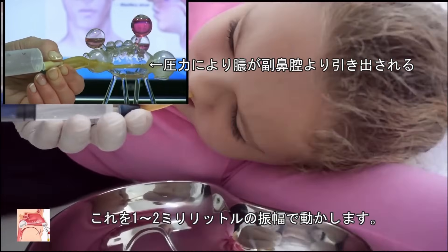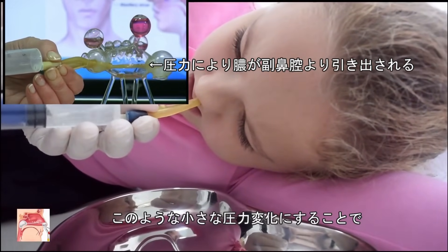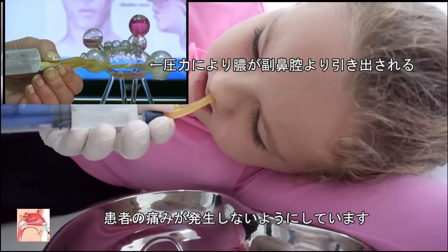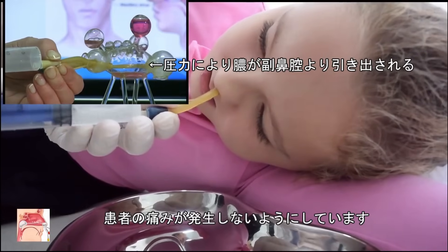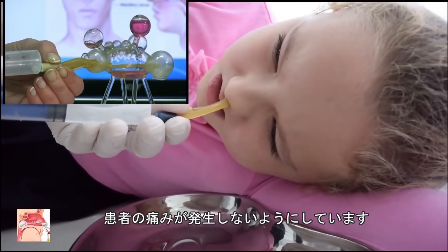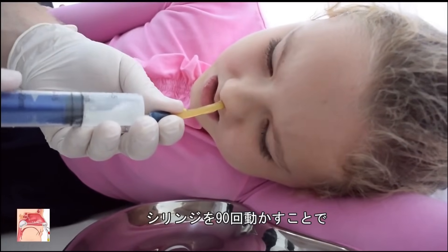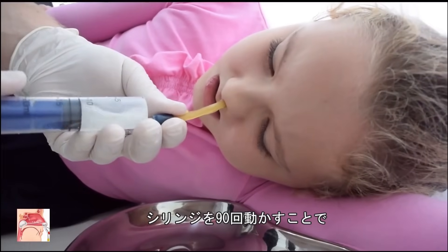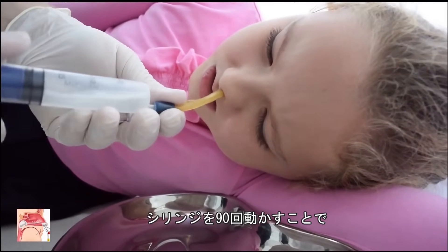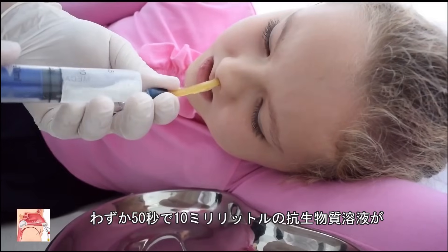The physician begins to move the plunger at a 1 to 2-milliliter amplitude. This is quite sufficient for the solution to start passing from the syringe into the sinuses. Such a small pressure change guarantees a painless procedure. The physician performed 90 back-and-forth movements of the plunger, and as a result, 10 milliliters of the antibiotic solution were injected into the sinuses in just 50 seconds.